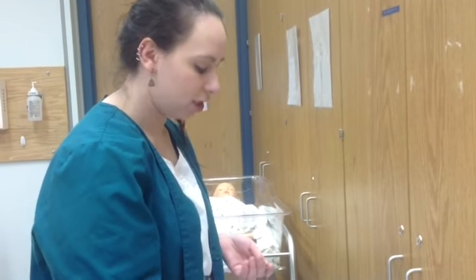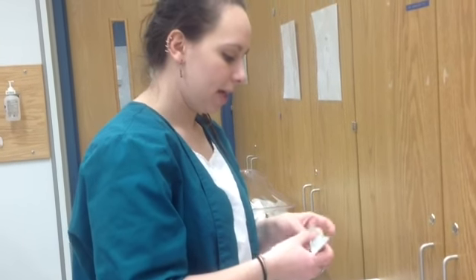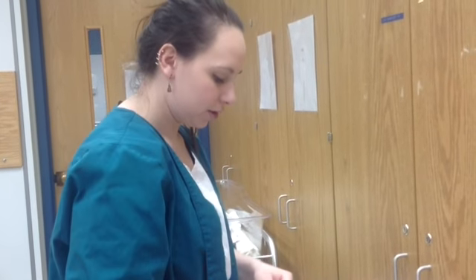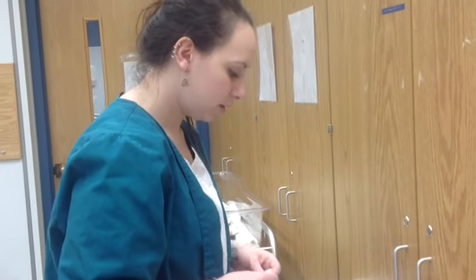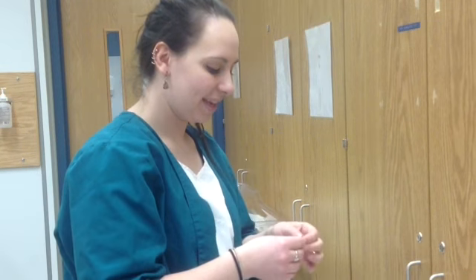I'm then going to need to get my supplies for this. An IM injection, you need to have the right syringe to hold it, so I need 1.2 milliliters. The best one I have for that is a 3 milliliter syringe available to me right now. This will hold the amount I need, and the increments are appropriate. I'm going to draw it up. So, oops. Try to find a clear space on a med cart.